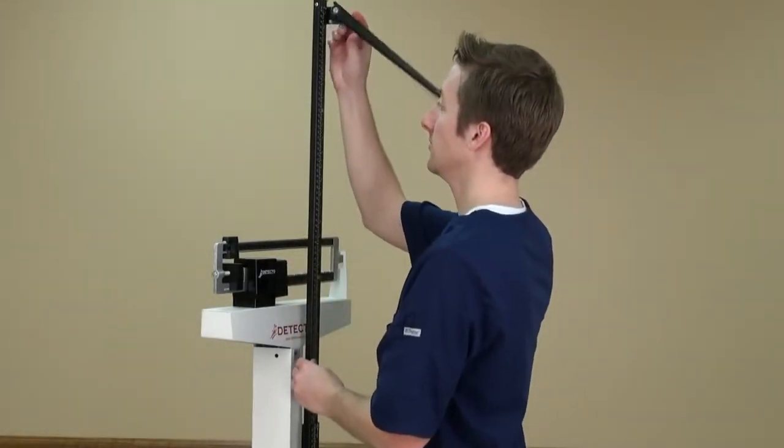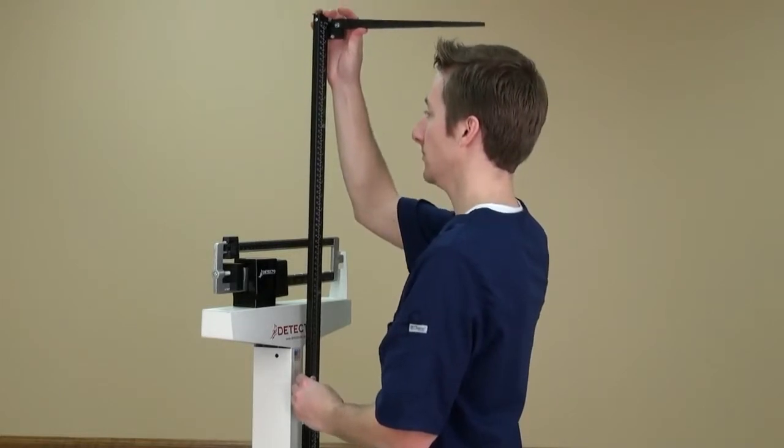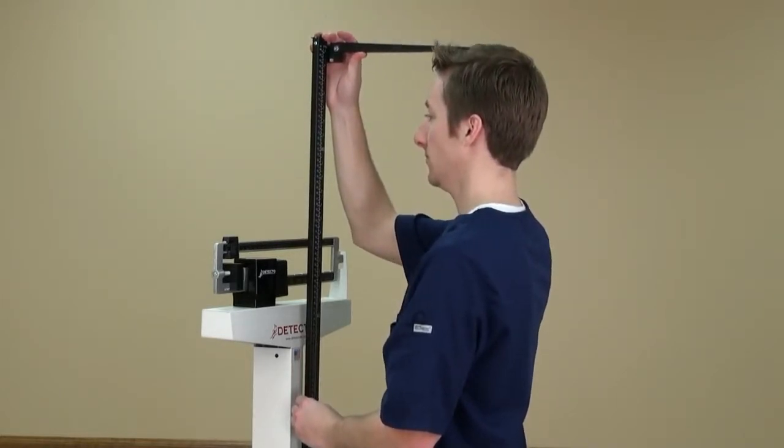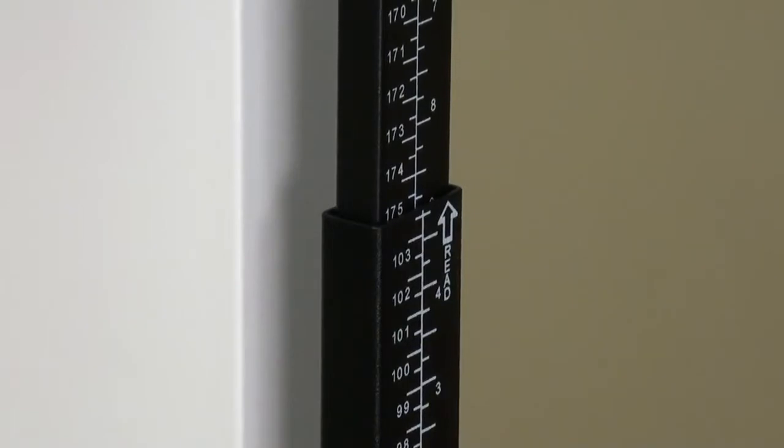Measuring height is quick and easy. Simply extend the height rod on the front of the column up, and the spoon out to the top of the patient's head, and then read the measurement along the front of the rod.